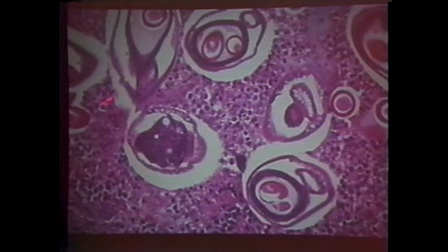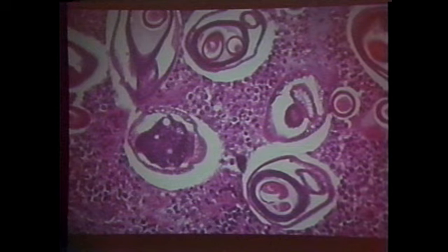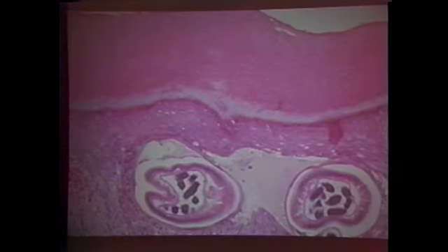And we have aphasmid type eggs. You know, here are the eggs. Trichuris and Capillaria have the same type of egg. It doesn't have an operculum. It has a bipolar plugged egg. There's mucinous material in there. An operculum is a little flap, just like part of the shell that pops open. These are plugged, and the aphasmids can either have larvae or not within the eggs. Larvae are not within the eggs.